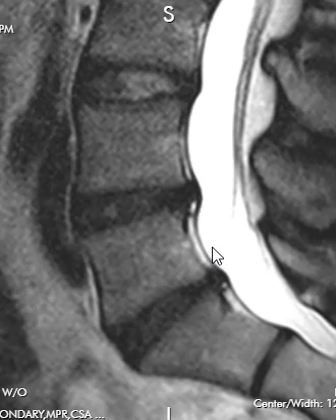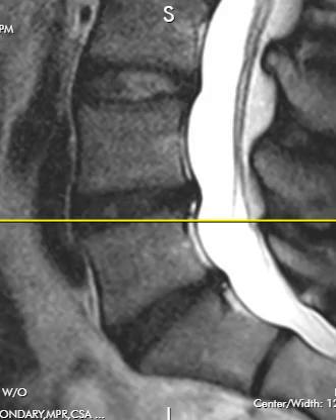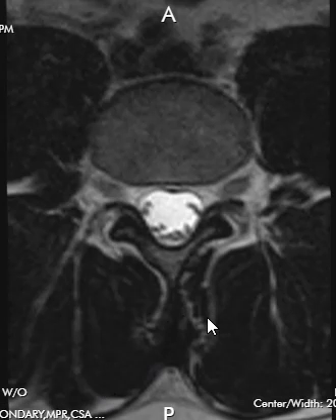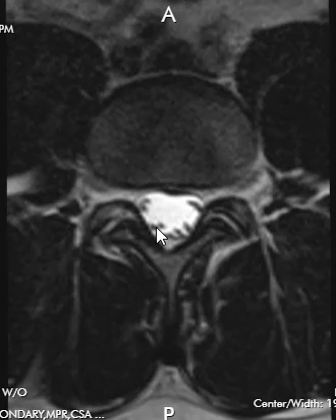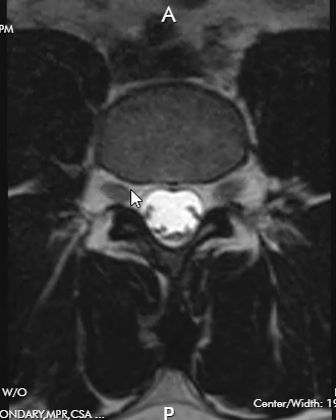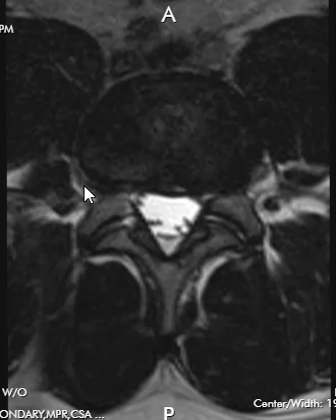There's one other finding. We look at another orientation called an axial image, where we go right through each disc. This axial image is just above the disc level — this is the very bottom of the L4 vertebral body. Behind that we see the spinal canal filled with white fluid, and these little things are the individual nerves going through the canal, exiting through the foramina. Here's the nerve in the right foramen and here's the nerve in the left foramen.